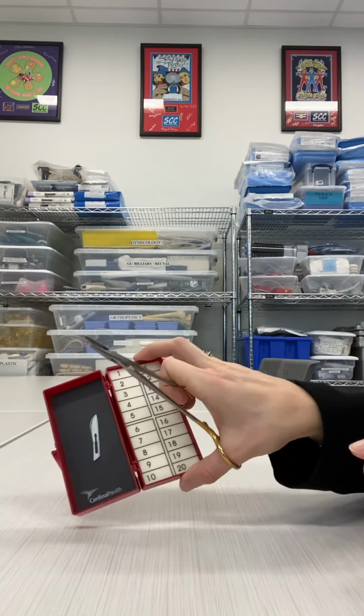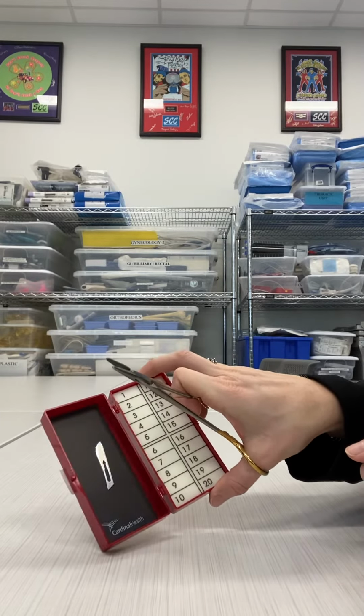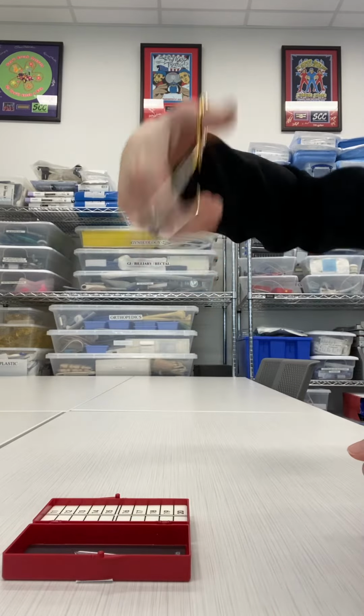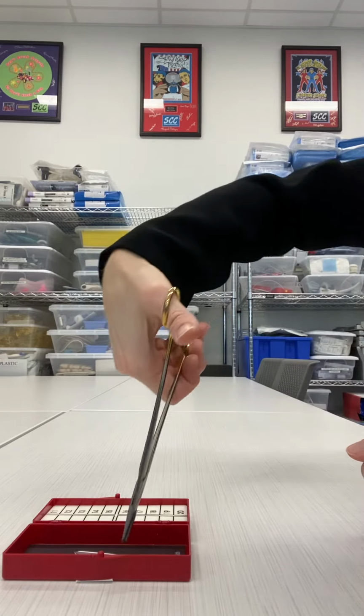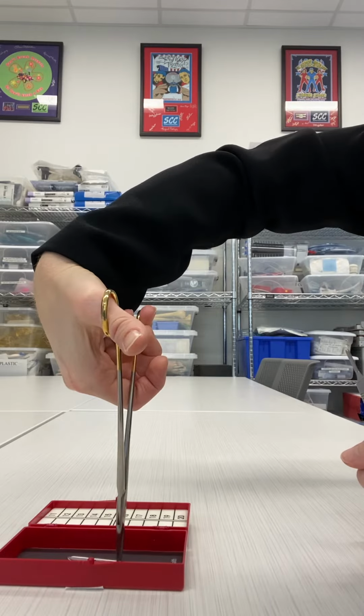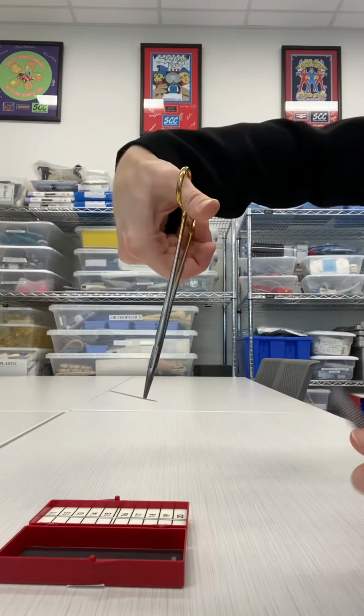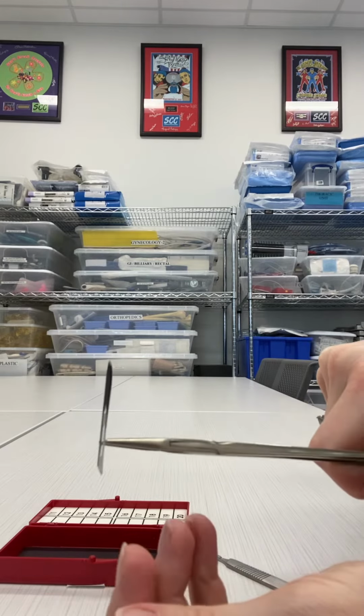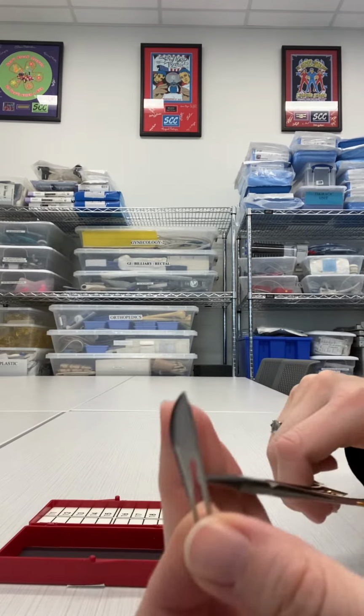So I've opened that into the magnet side of my needle book. I really want to make sure I touch this the least amount with my fingers. So I'm going to use my needle holder to come down into the cutout section of that blade and pick it straight up. Now I am going to have to touch this to reposition it, but I make sure I do that below the cutting edge here.